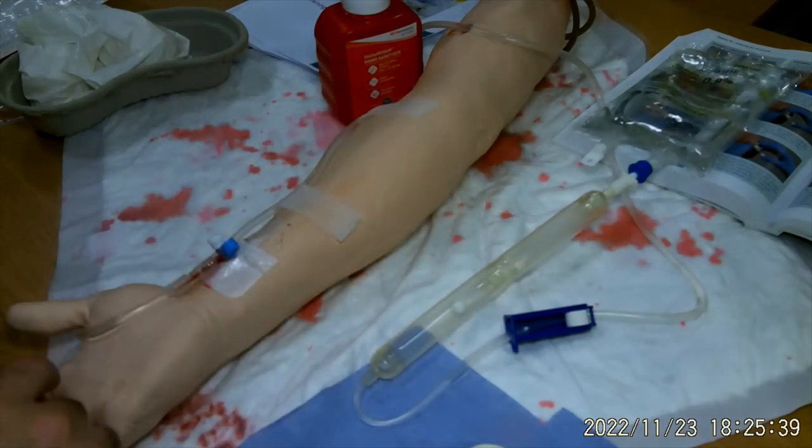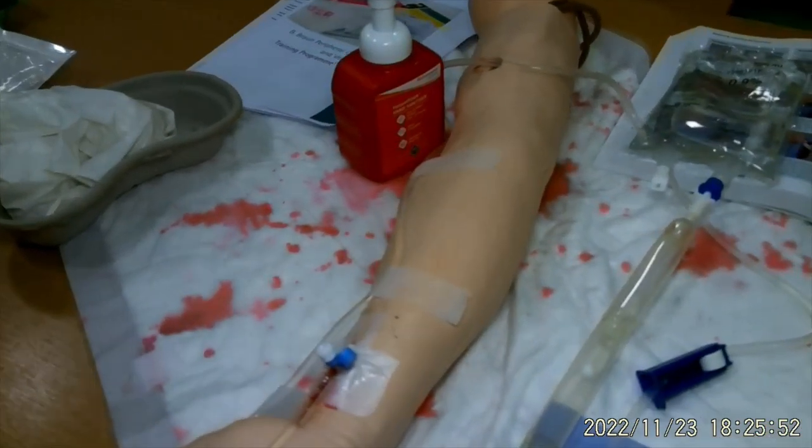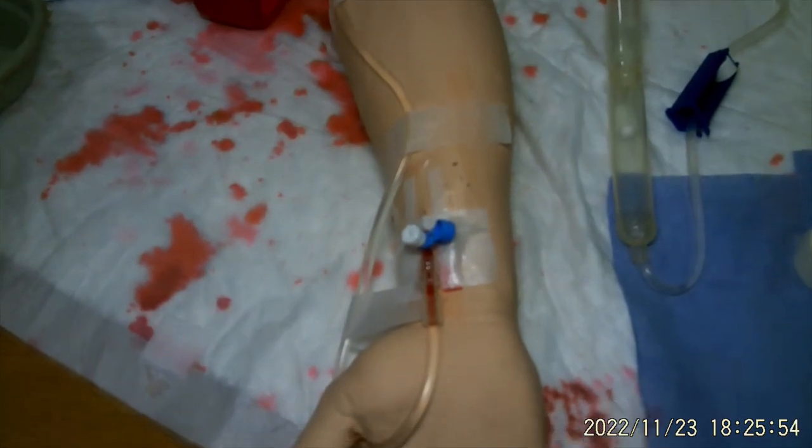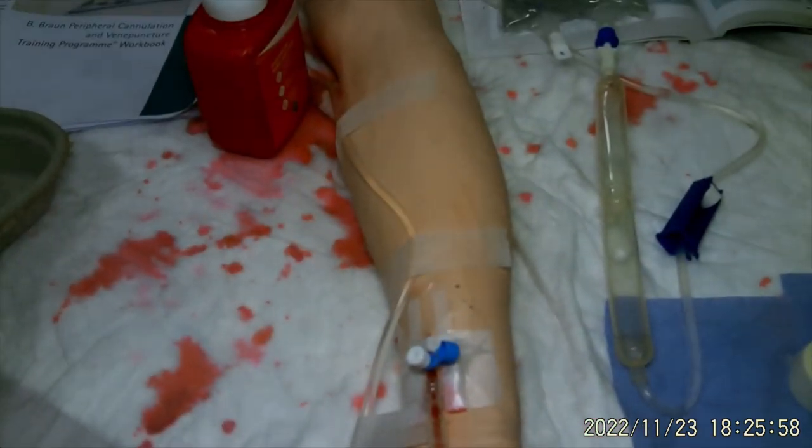The assessor would then come and check the patency of my cannula, maybe with a flush to make sure it is actually in the vein, and they would check the whole of the giving set for any bubbles. Hopefully that has helped give you a bit of an indication of what you're going to have to do in your OSCE — that's how we'd like to see it done.